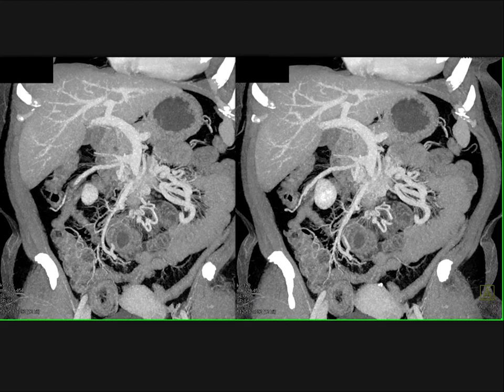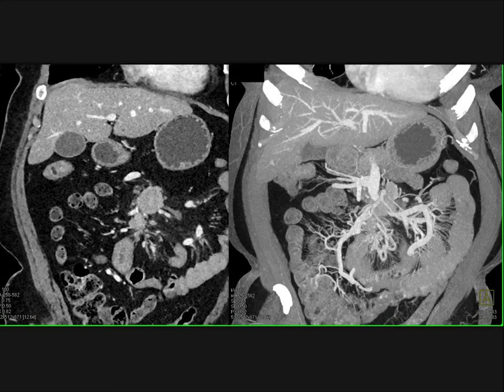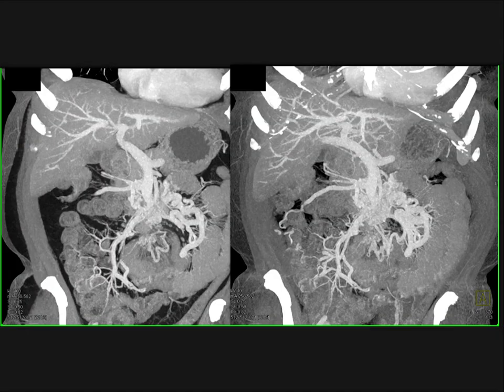And you can see when you go down to the MIP, the mesenteric mass occluded the SMV confluence, huge collaterals around the SMV, infiltration into the mesentery. Here's another view of that infiltration. And here's another view showing you the desmoplastic reaction, showing you the arterial and venous involvement, showing you particularly impressive the occlusion of the SMV. So once you start seeing desmoplastic reactions, I'm always thinking of carcinoid tumor, so you're thinking about neuroendocrine tumor, and that becomes very important in both arterial and venous phase imaging.